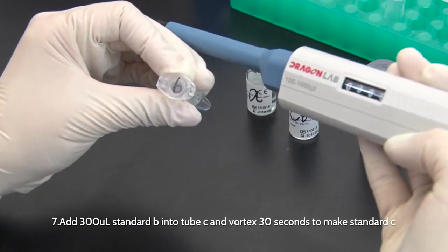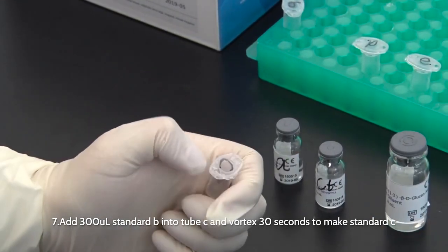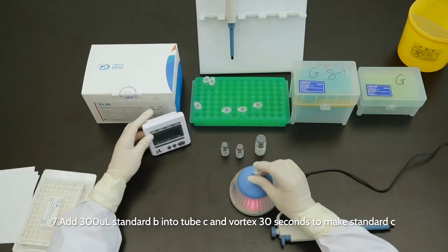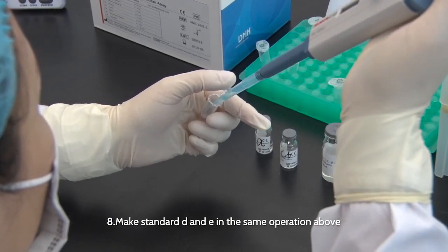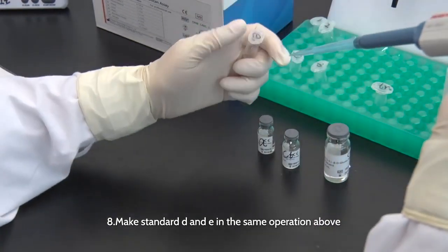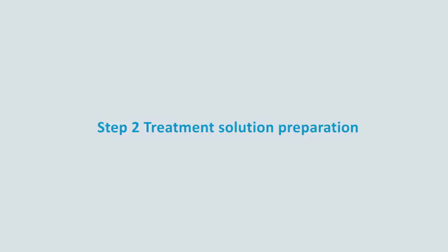7. Add 300 microliter standard B into tube C and vortex 30 seconds to make standard C. 8. Make standard D and E in the same operation as above. Step 2. Treatment solution preparation.